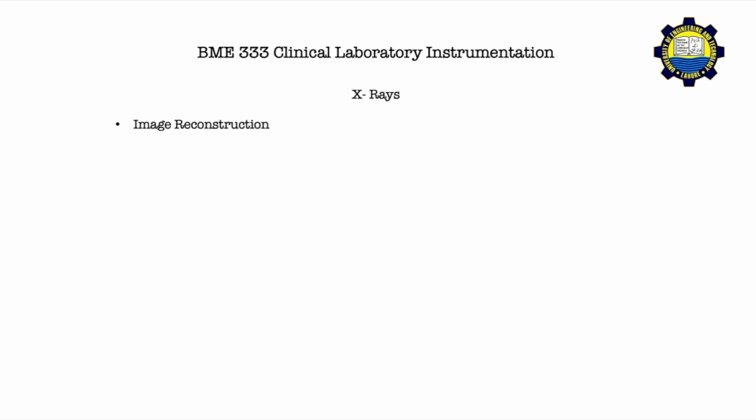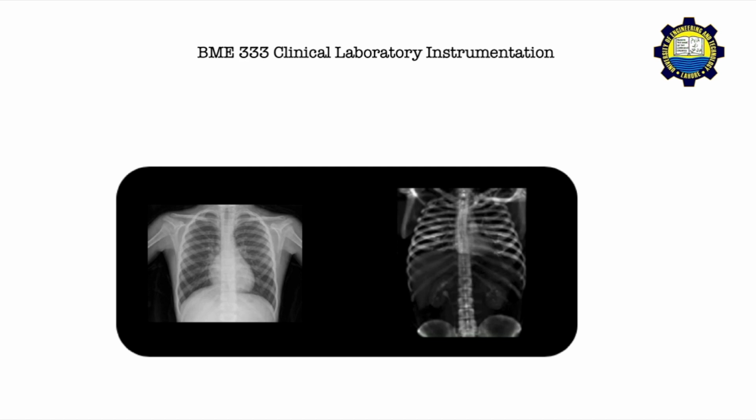The final topic of discussion today is image reconstruction. Now, I said earlier we're going to link this with computed tomography, so let's give it a go. So the key difference between the two images, as you see them right away, is that one of them is a two-dimensional image, whereas the second image is giving more information in the third dimension as well. So I'll make this clear.